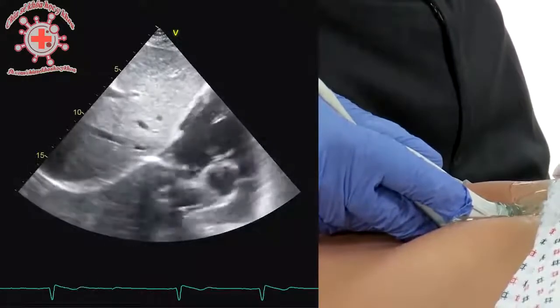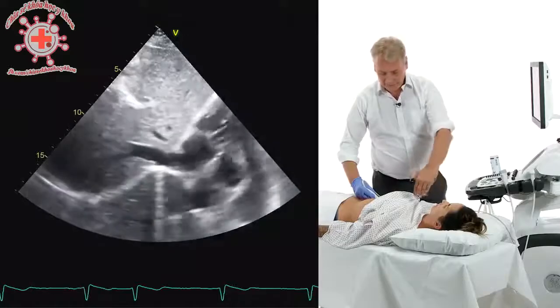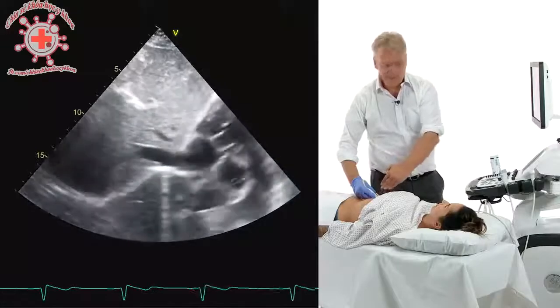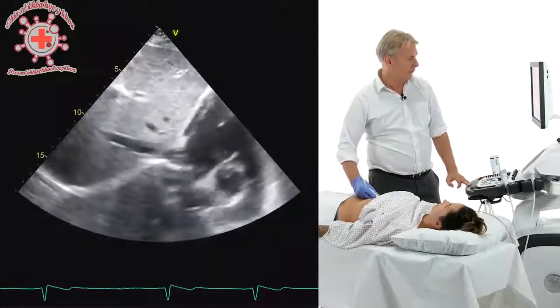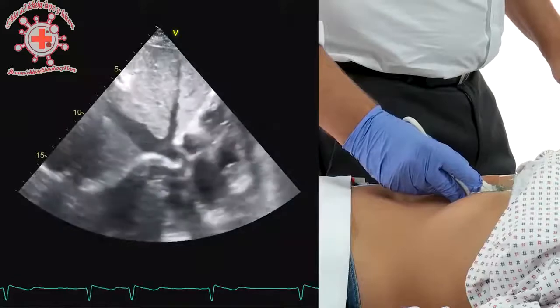Remember, we now have an orientation of the IVC which is in longitudinal direction, just as we have the transducer oriented, and we are a little bit more to the right of the midline. Here you see the IVC, and if you move the transducer back and forth a little bit, also the hepatic veins, how they enter the IVC.